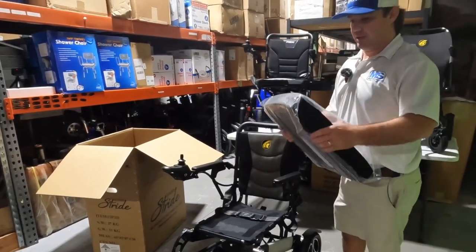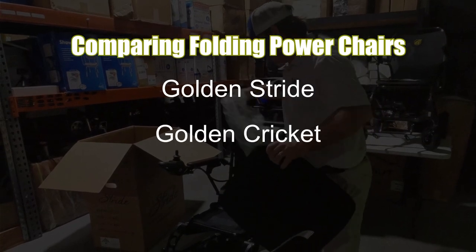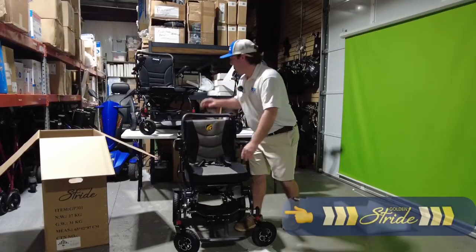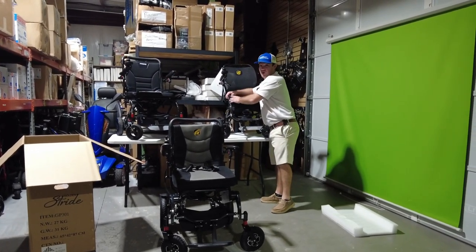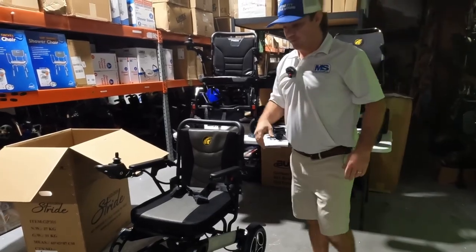Now here's the seat — the cushion. I can already tell it's a lot nicer than both of these cushions. Just remember, this is a pretty hard cushion, but all of them can be removed and changed out to whatever cushion you prefer.